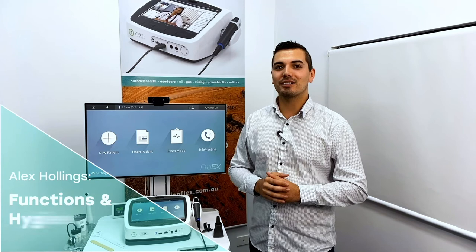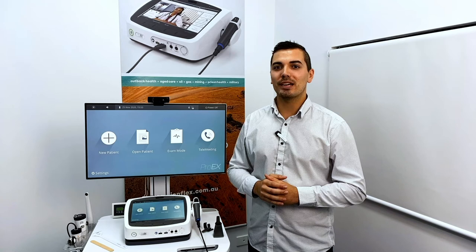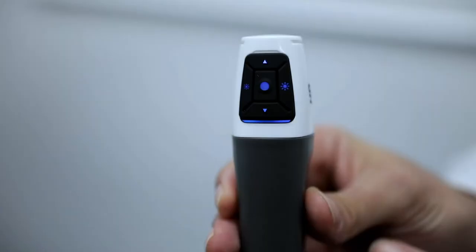Hi, I'm Alex and today I'd like to run you through the functions and hygiene procedures for the GEIS General Examination camera. The GEIS camera has an automatic focus which is on as soon as you connect it to the Pro EX. You can change to manual focus by pushing the top and bottom buttons on the top of the device.